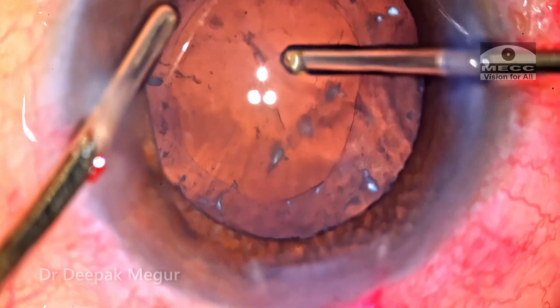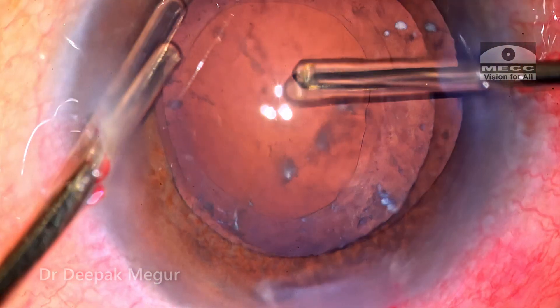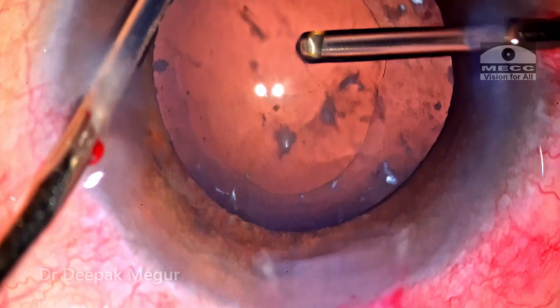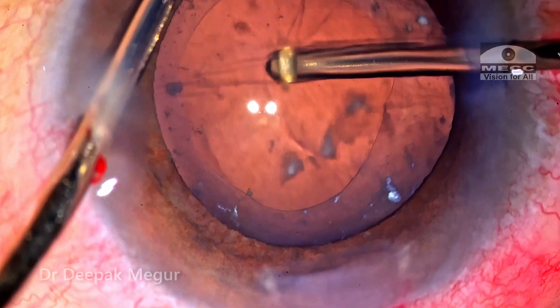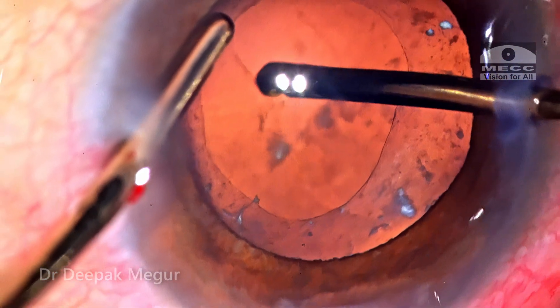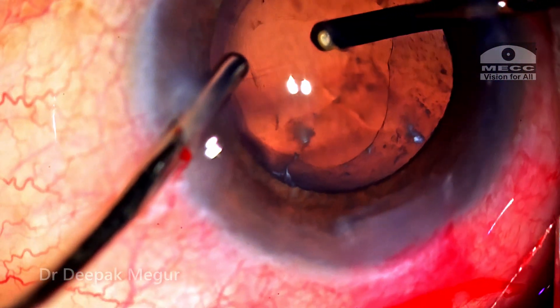The red glow is excellent and now is the time to implant the lens. But before doing that, I want to ensure that the posterior capsule edge is not in the visual axis. So I'm enlarging the posterior capsulotomy a little bit so that the visual axis remains clear. I'm using the regular irrigation, cut, and aspiration mode — the cut rate is around 4,000 — and gently the posterior capsule rhexis edge is enlarged.